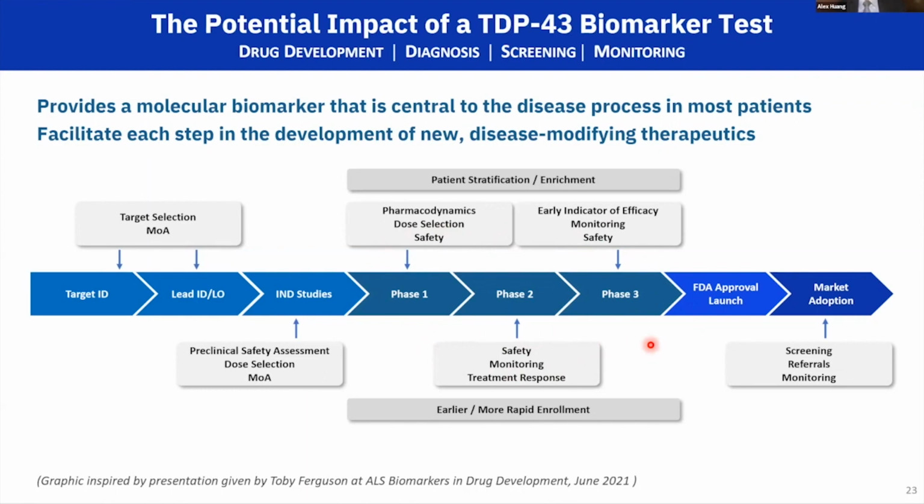For instance, one of the problems in a lot of clinical studies is figuring out whether the patients who are enrolled really have the right disease at about the same level in both arms of the study, right? And so this is where better diagnosis or phenotyping of ALS patients using a test like the Amydis eye test also facilitates developing better therapeutics in the future as well.